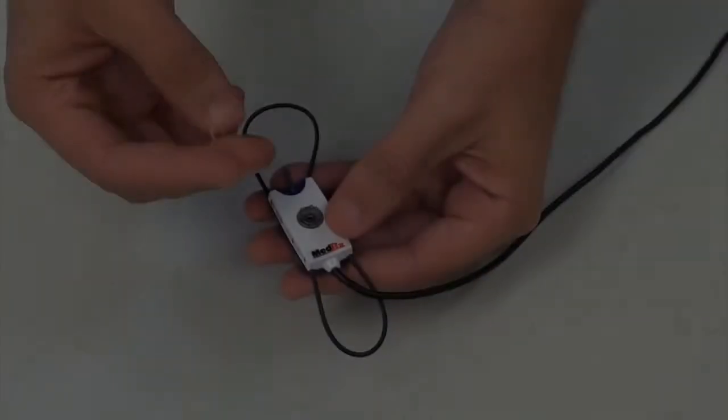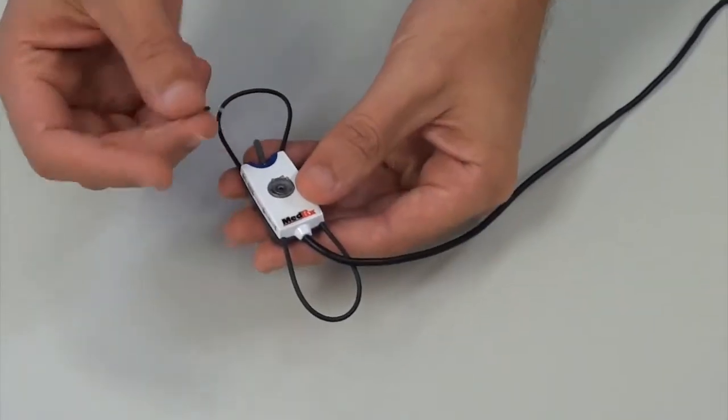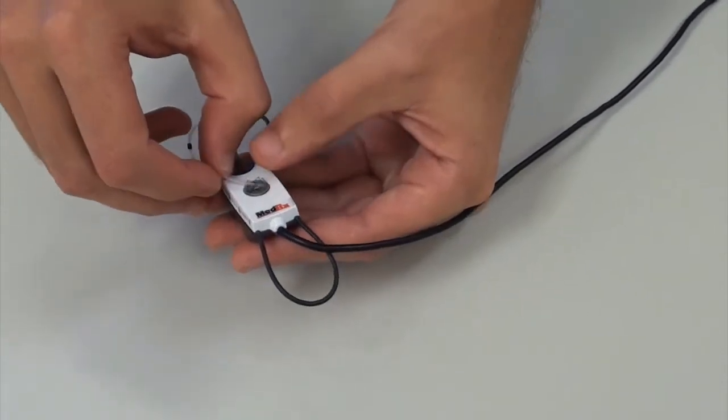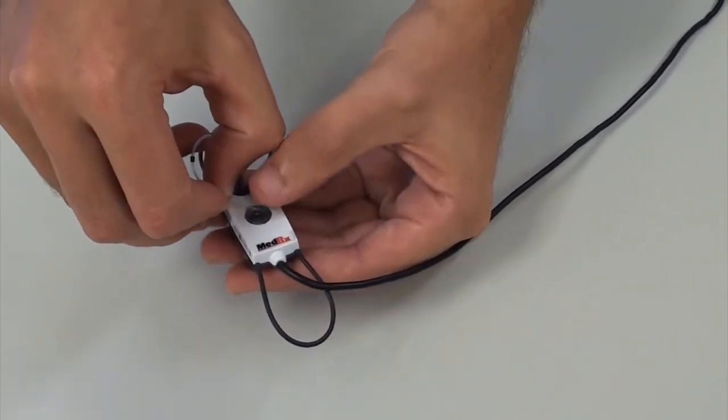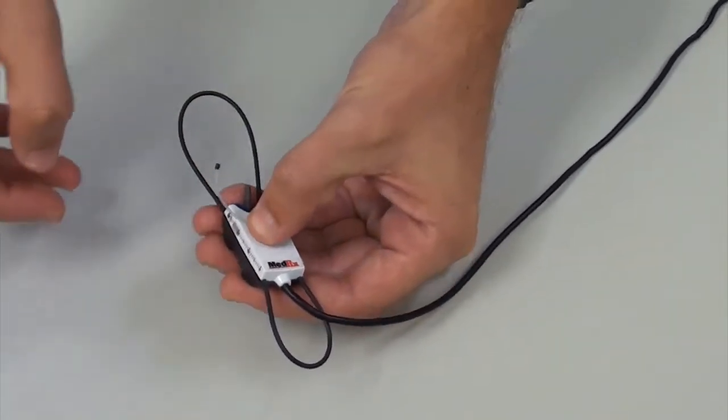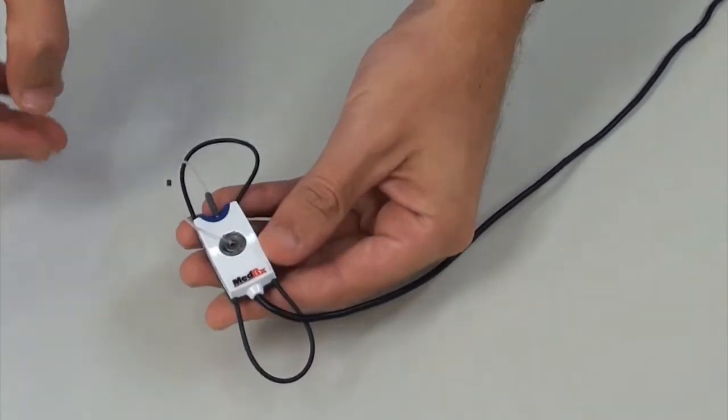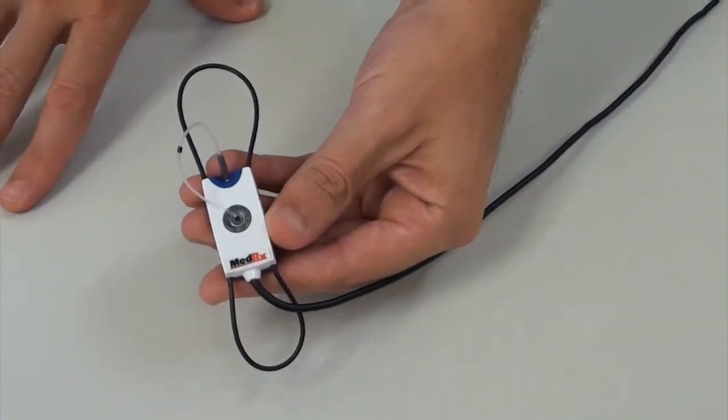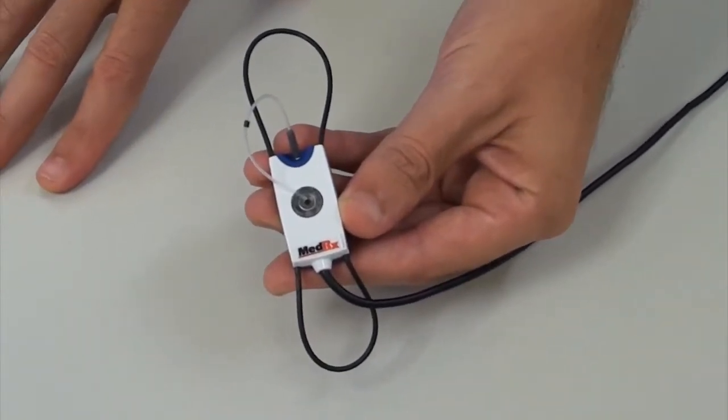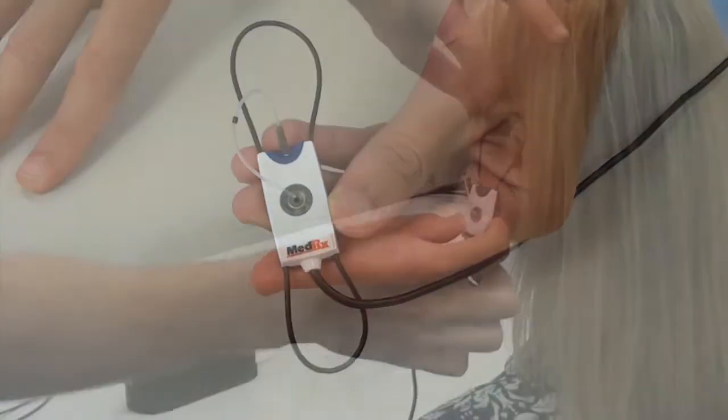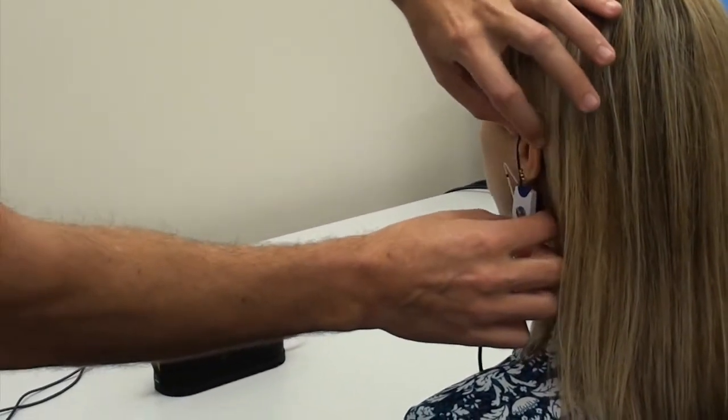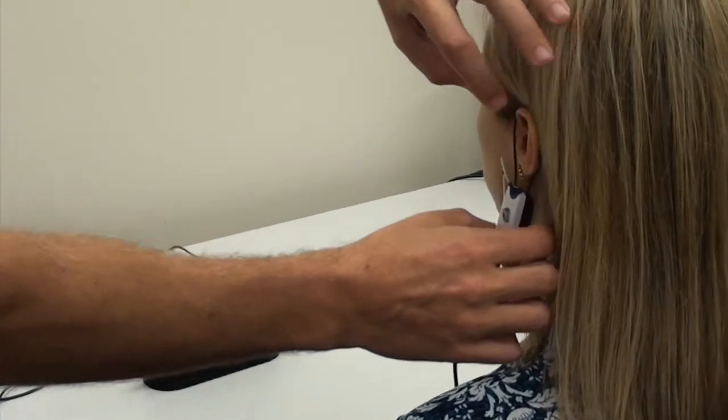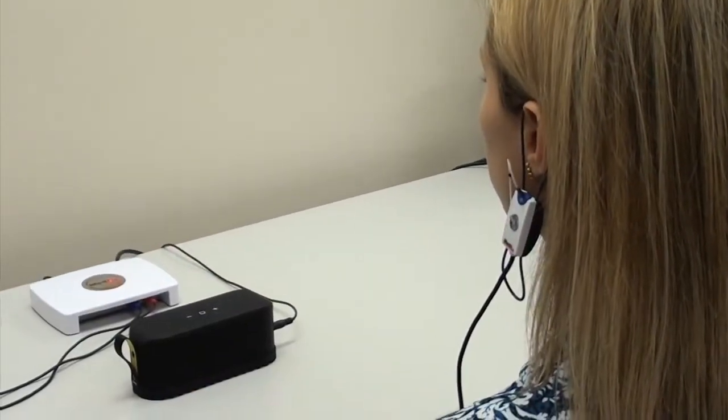You put the probe tube in calibration position. Now we're going to place the probe mics on the patient's ear and you're wanting to have that probe mic sit at the bottom of the ear lobe.